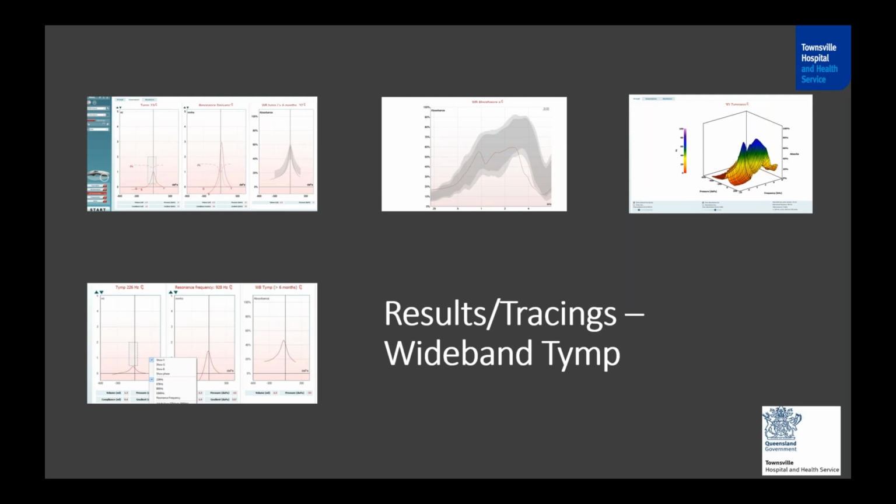From my understanding, they're not given simultaneously. The activator is given, there's a slight delay of a few microseconds, and after that the click is presented. So there's no interaction between the activator and the click stimuli. Yes. So there's no impact by the activator on the absorbance level. No.